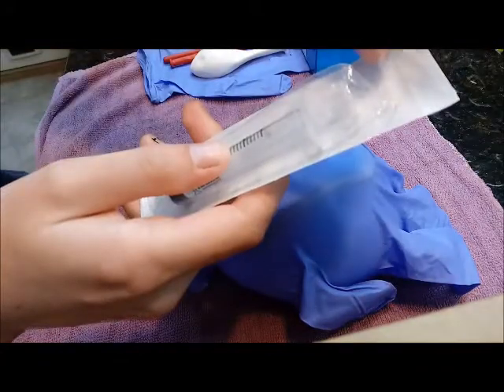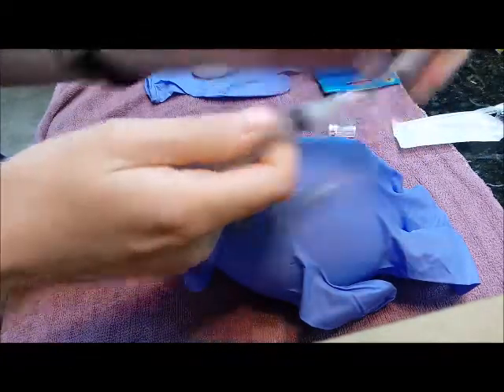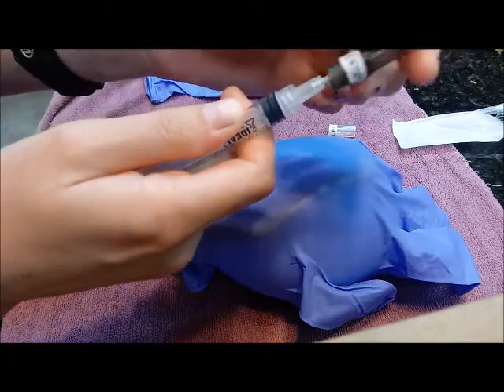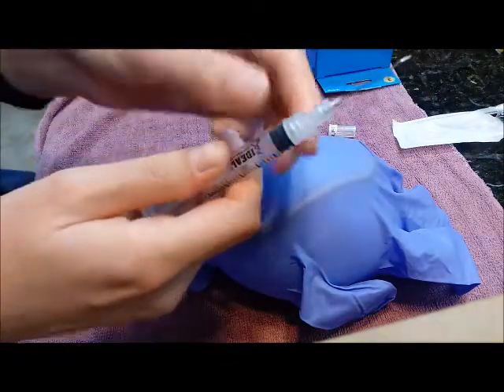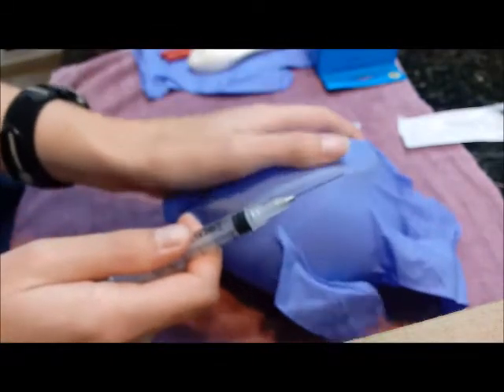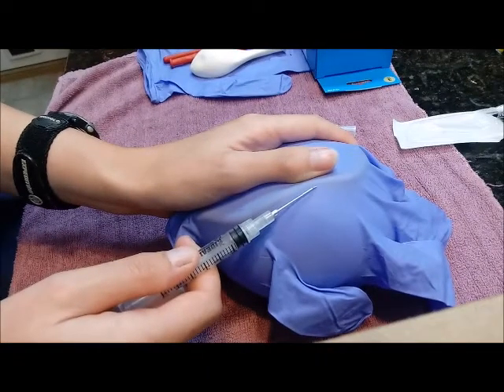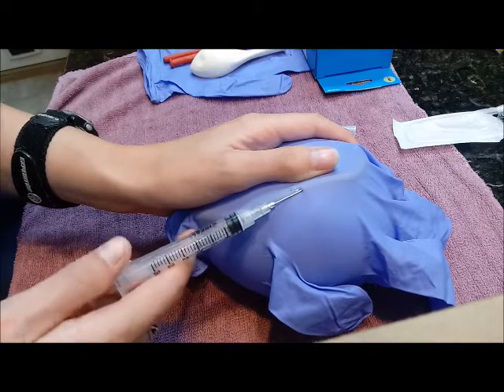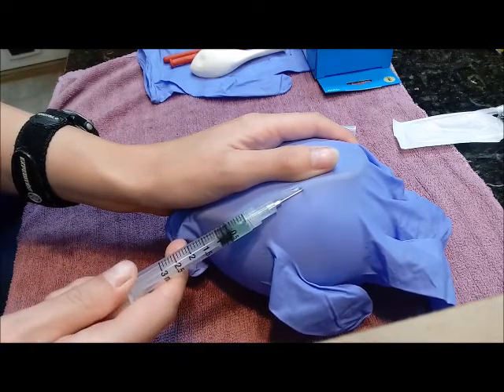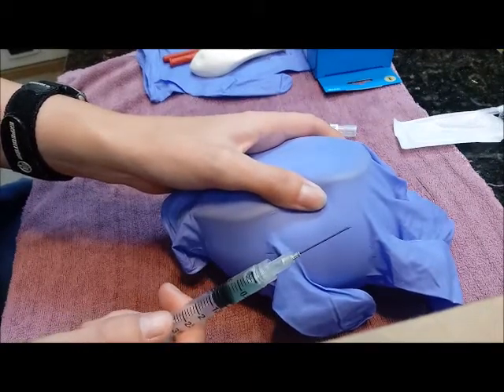There's my syringe, and instead of peeling it open from right here, the easiest way to get it open is to push it out just like that, and then twist that off. This is why I like Lurelocks — that way you can just twist the needle right on there, and when you take the cap off, you don't have to worry about the needle sliding off the syringe. Take the cap off, you want the bevel up — bevel up — use your thumb to brace the vein to keep it from moving, and then you're going to want to come in at a side angle. Poke it in right there, and then once you go in, you're going to pull back and you're going to get a little flash. You can see the different color — you get a flash of soap — put your thumb there, pull out, and that is how you simulate drawing blood at home.